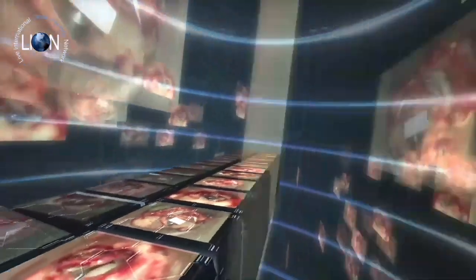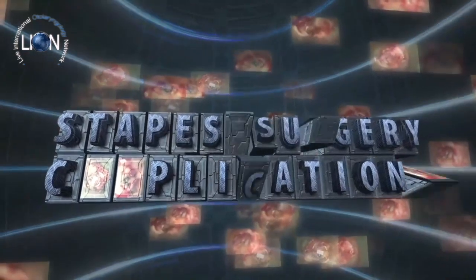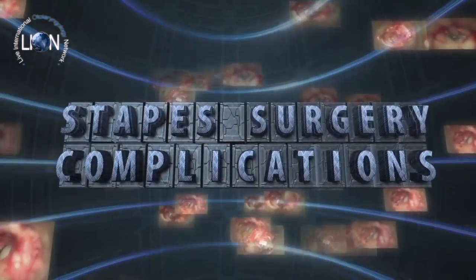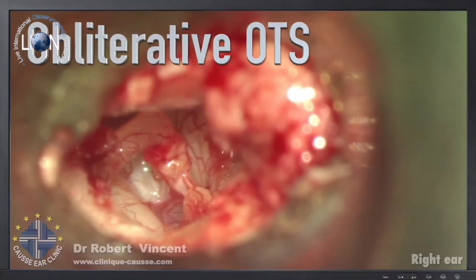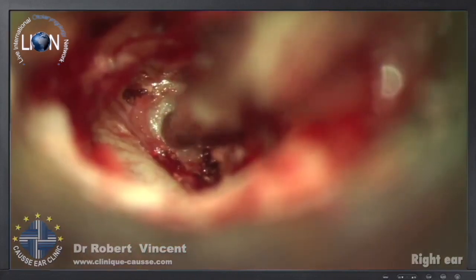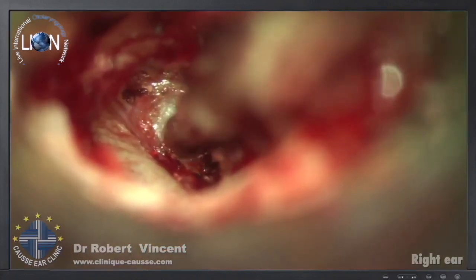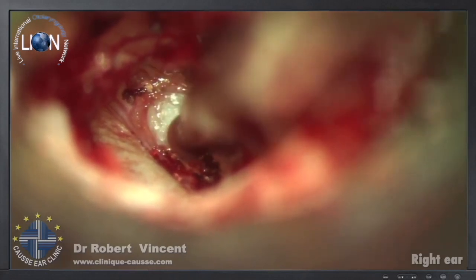Now, if we talk about the complication, that was the basic stage of surgery. So now we can say a few words about the difficult complication about this surgery. The first one is a case of obliterative otosclerosis like this. You can see a huge focus. So you see I'm drilling out in a different way. I'm not performing a straightforward stapedotomy.